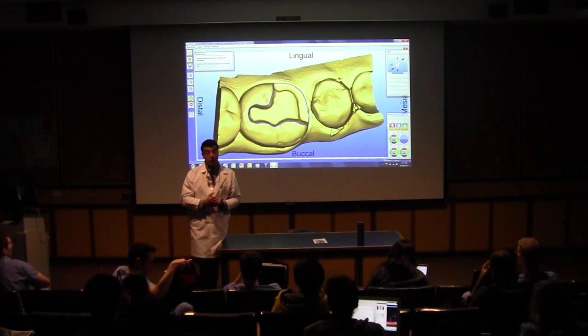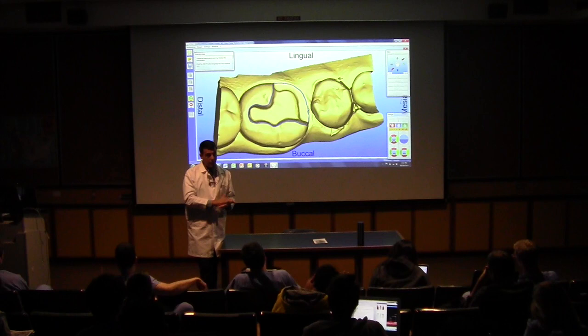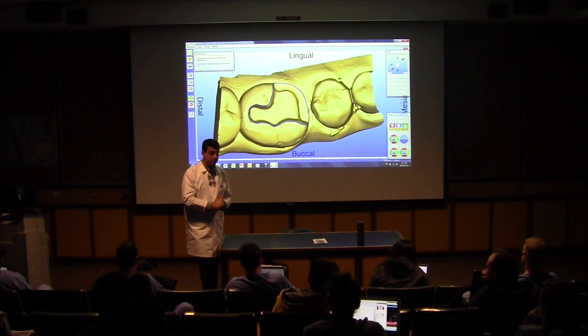You don't need that. Doing that, you're actually compromising the cusps. Remember resistance form? You're shaving down too much, denting enamel, you're compromising the cusps. Don't do that. I will not be happy. Instead of doing an inlay, you might have to do an onlay.